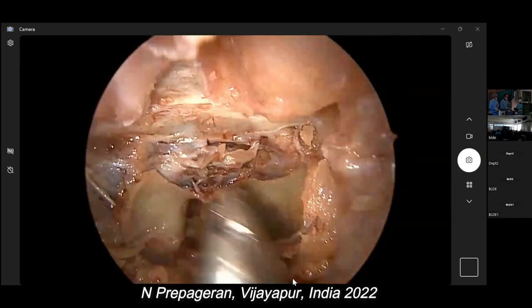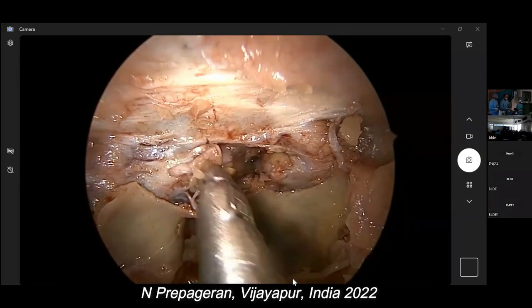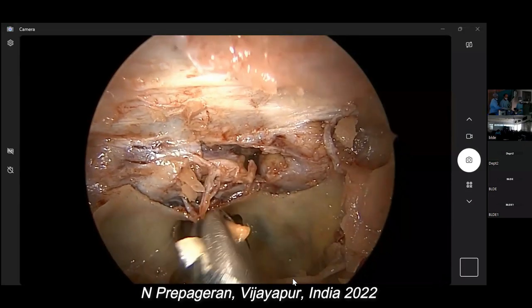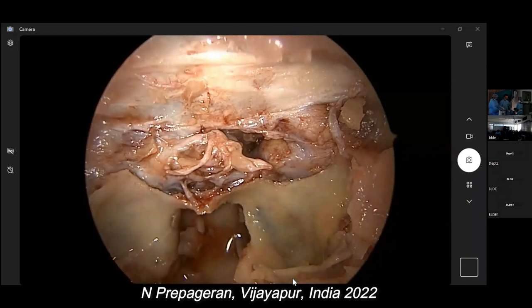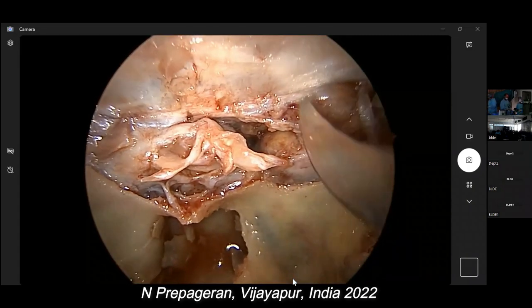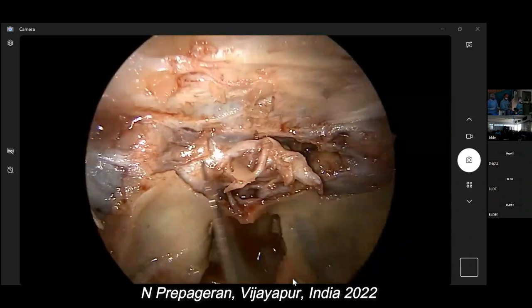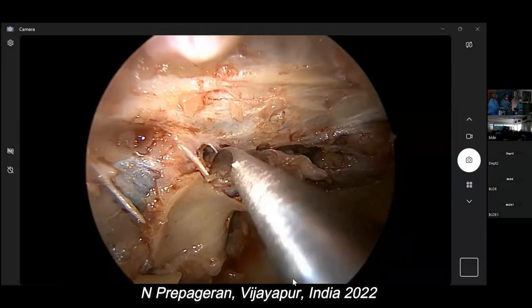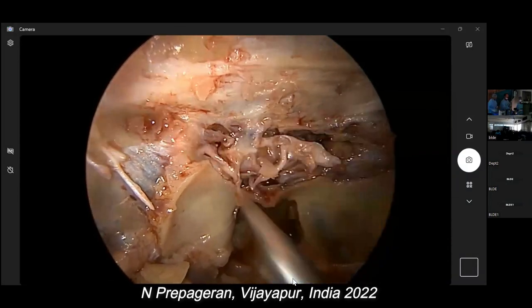Now let's take out this mucosa, this dura. I think there's stuff inside here. It's fine, don't worry about it. We'll just continue. So here, the same way, there's a superior hypophyseal. Down here will be the inferior hypophyseal. So now I want to cut the plane between the pituitary gland and the carotid artery on this side.